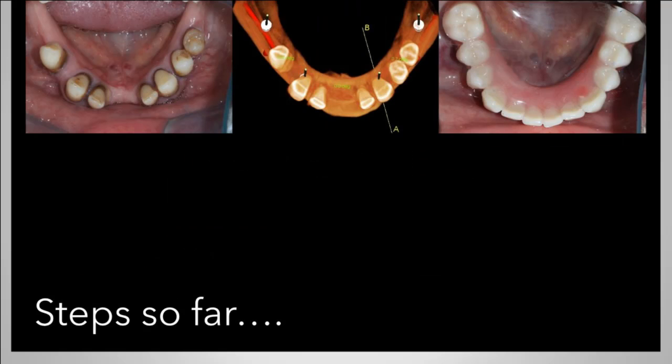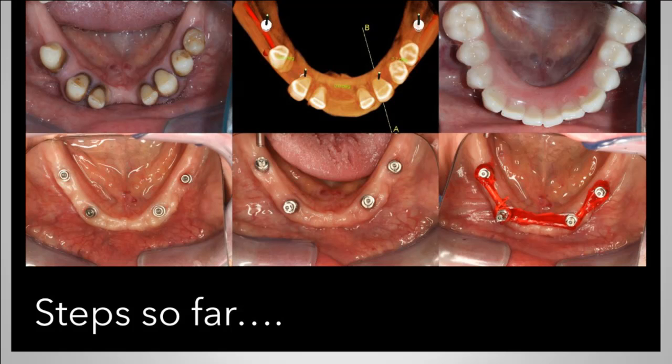And the step-by-step from the lower is to start to basically treatment plan where the implants are going to go, to construct some sort of provisional restoration. From there, to then take an abutment level impression to splint the impression copings. This is Duralay that we've used. This is light cured pattern resin with some floss to help guide it.